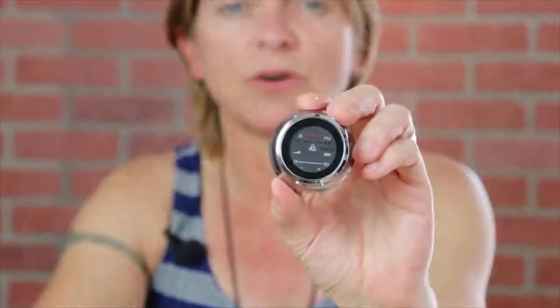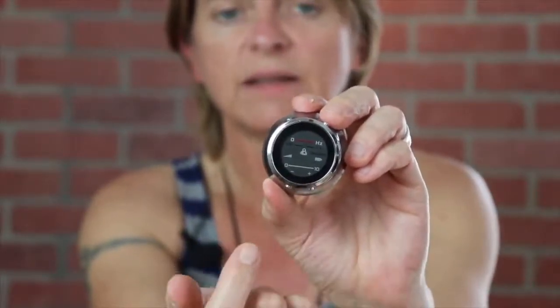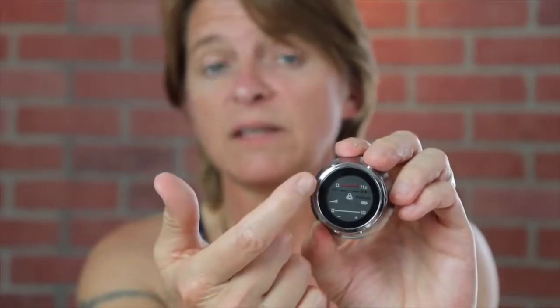The ThinkLabs One is rechargeable — it runs on a lithium battery. The face of the stethoscope has a few features: on the very bottom is a volume scale from 0 to 10. This stethoscope amplifies 100 times more than a regular stethoscope. The middle indicator shows your battery level, and the top dial controls the Hertz, which is the frequency — essentially toggling between the bell side and the diaphragm side. You have to play around with the Hertz depending on your hearing loss.